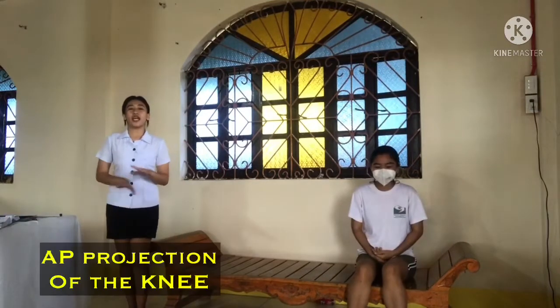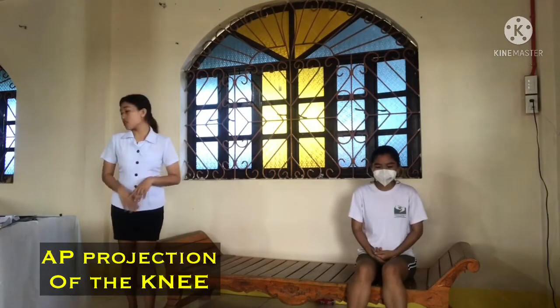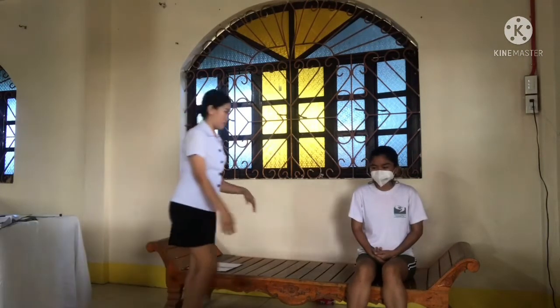So we proceed to the AP projection of the knee. So the IR used must be 24 by 30 cm lengthwise. So place the patient in supine position and adjust the body so that the pelvis is not rotated.